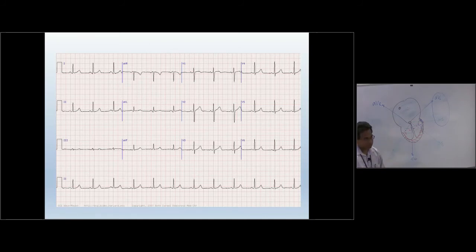So in year 2 level ischemias, mainly we are discussing left ventricular ischemias, and mainly either inferior, anterior or lateral. In year 2 we don't discuss right ventricular ischemias or posterior ischemias much. They will discuss those things in advanced years. Understood this one? You need to remember this one. As I mentioned earlier, this is the basis of ECG.